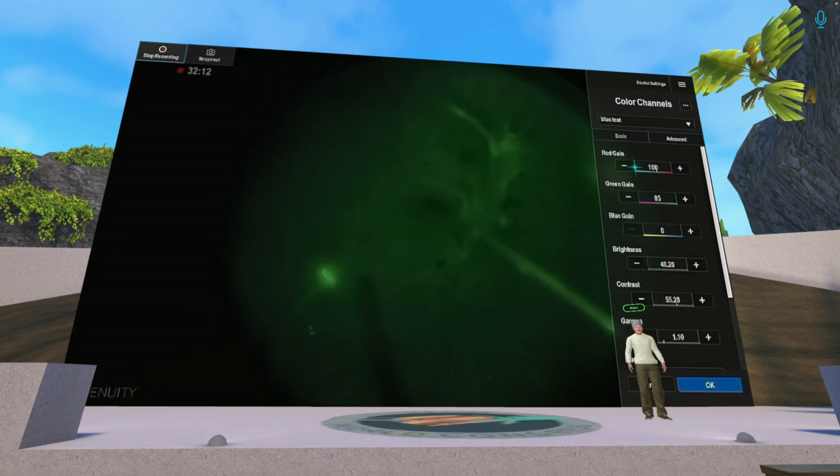I think that's important. I think we need to have a section on it. In a little over a week I'm going to look at a bunch of different filters with the Constellation light source. I think Lukan has done that as well.